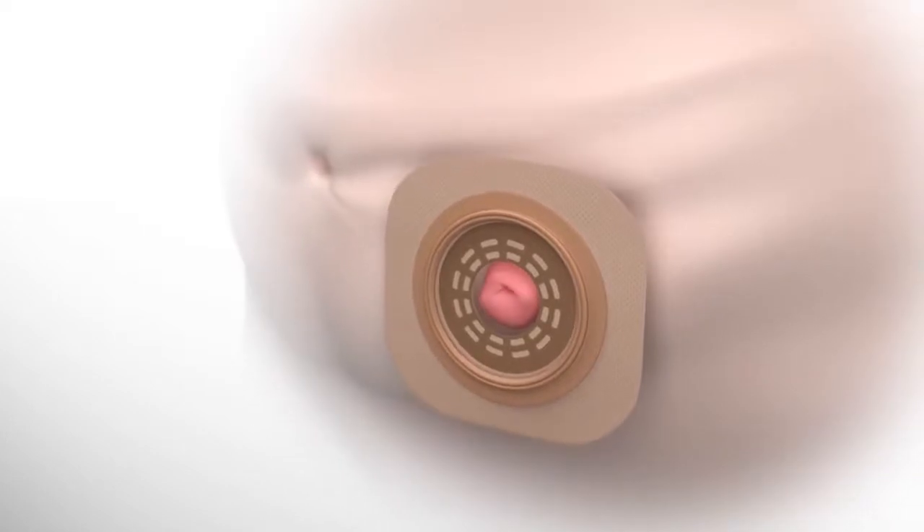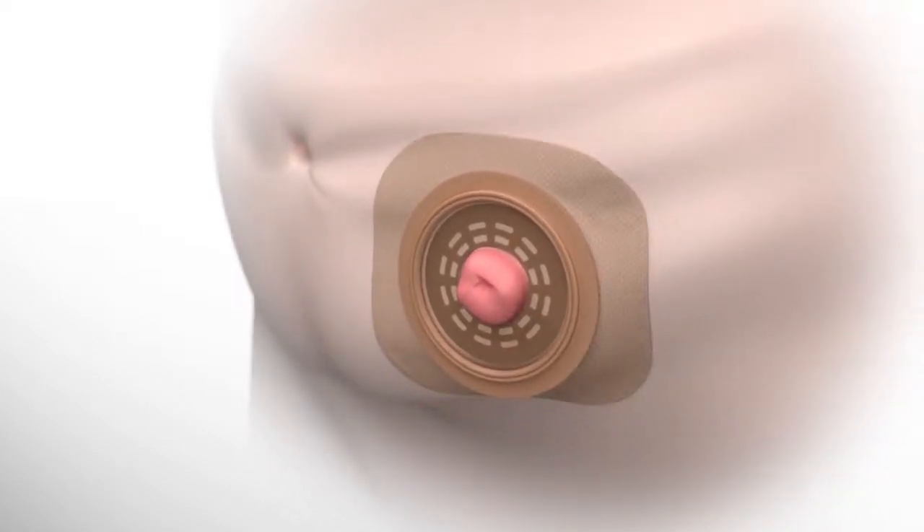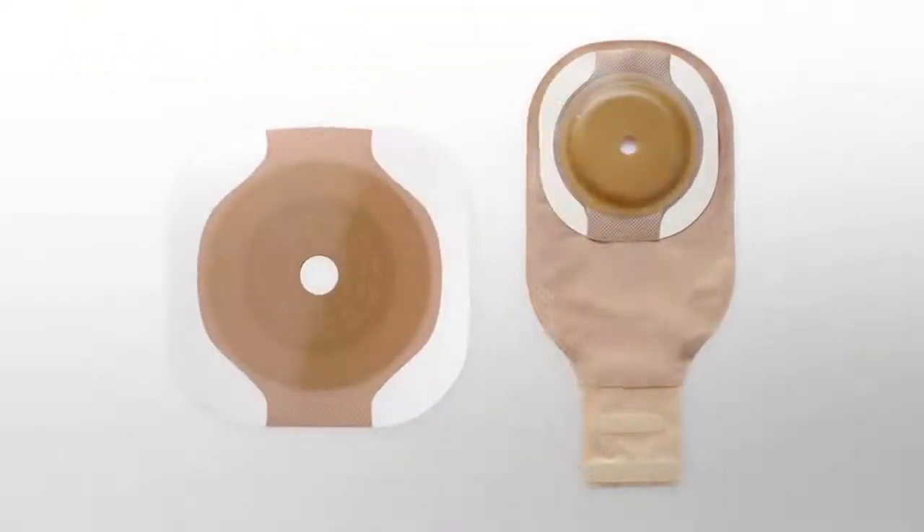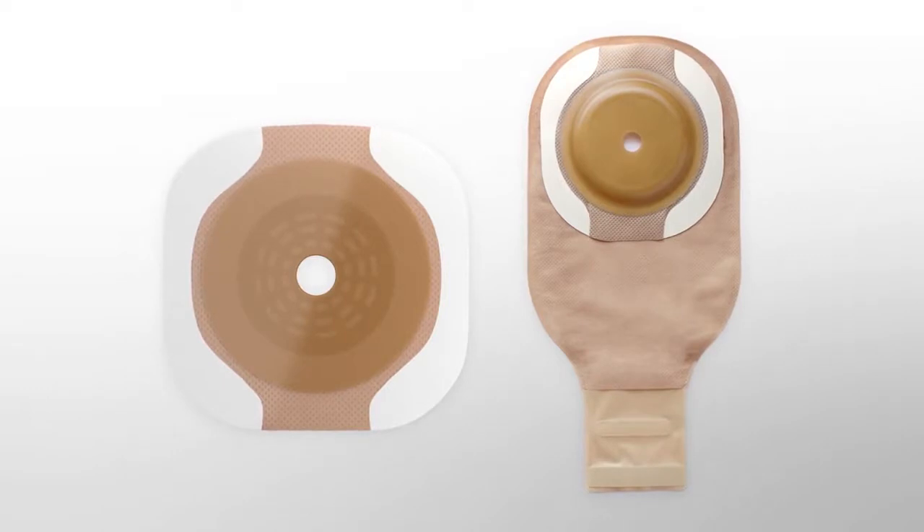It easily conforms to fit abdomens with skin irregularities, creases, and folds. Plus, the adhesive border barrier is available with most Hollister ostomy one- and two-piece pouching systems.